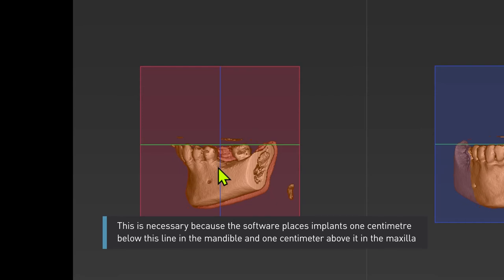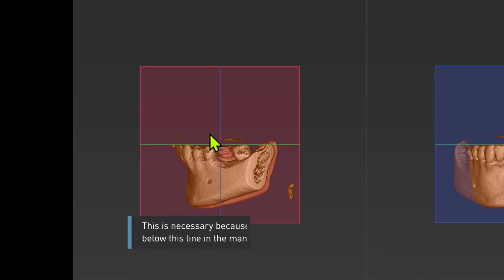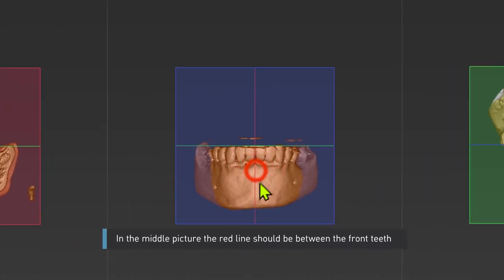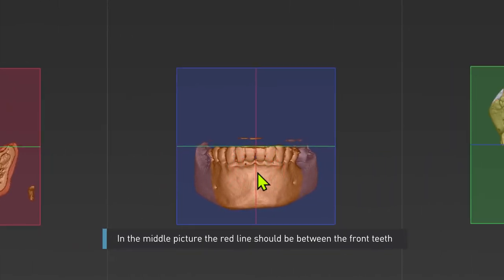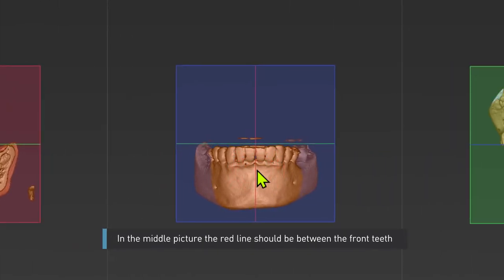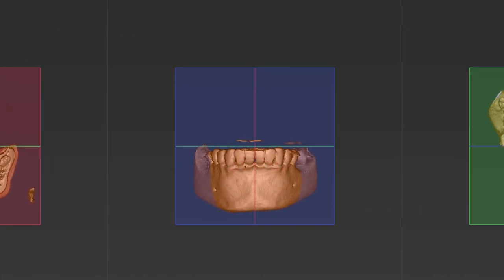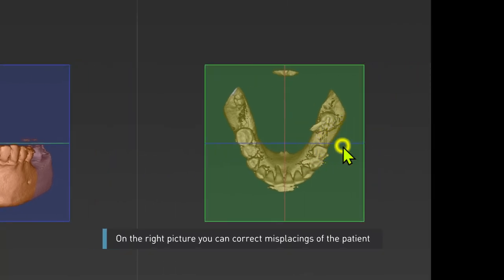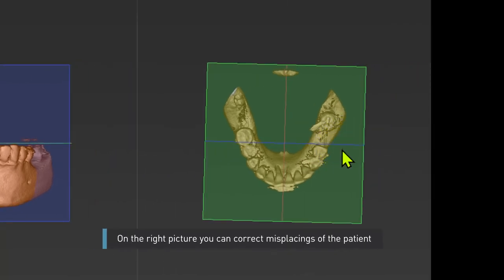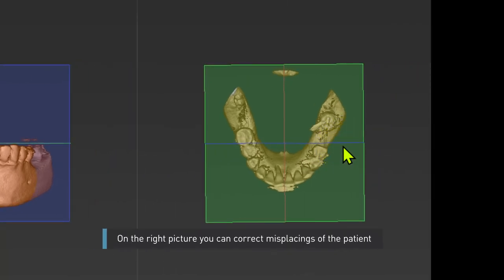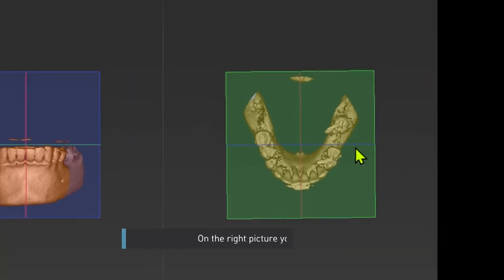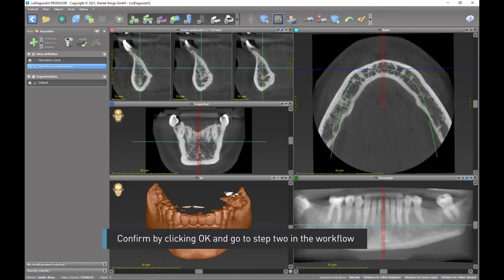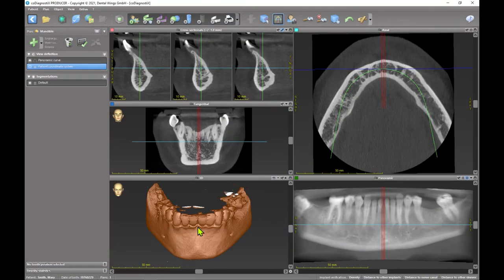In the middle picture the red line should be between the front teeth. On the right picture you can correct misplacings of the patient. Confirm by clicking OK and go to step 2 in the workflow.